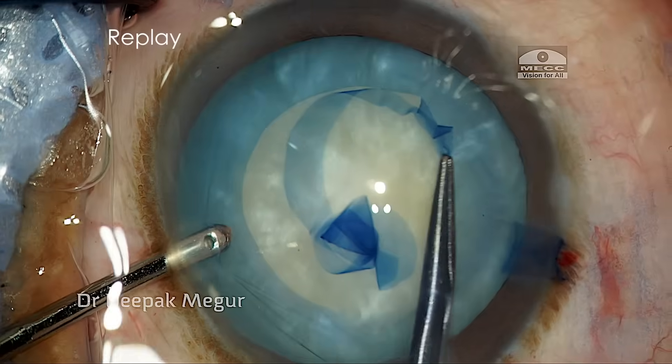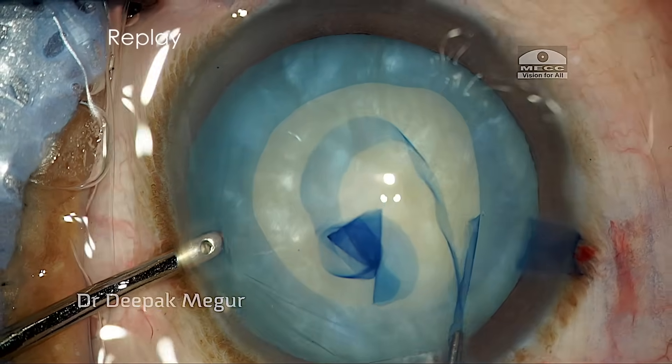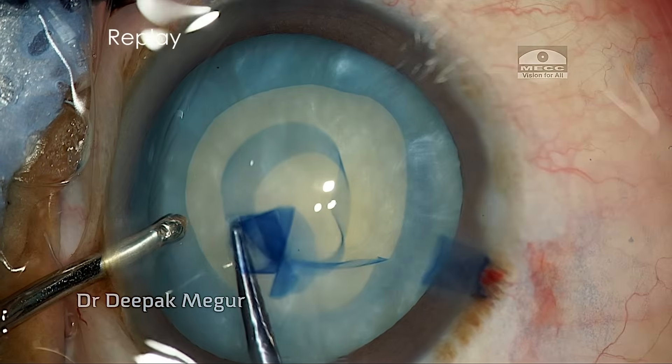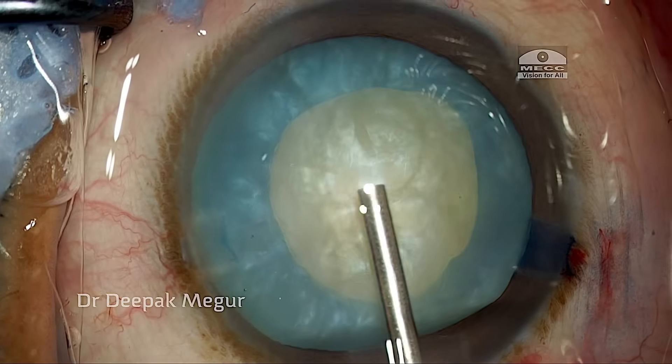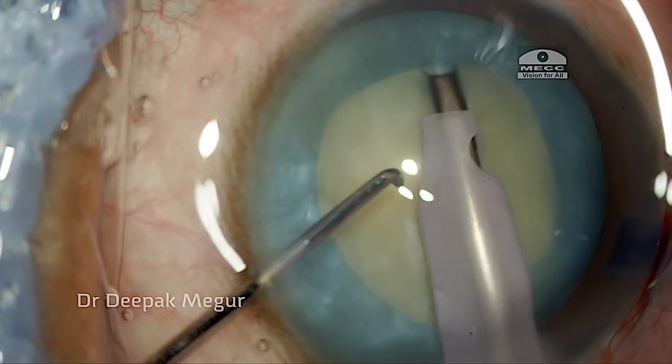Since we are circling around with a thin flap of capsule, it is referred to as the whirling technique. The obvious advantage with this technique is that we can control the tear in a better way because of the thin flap.